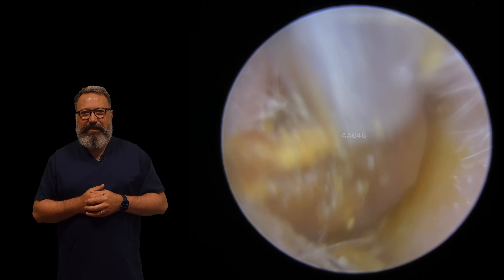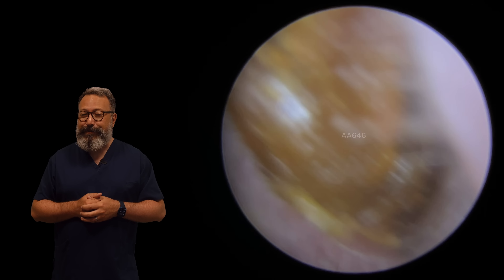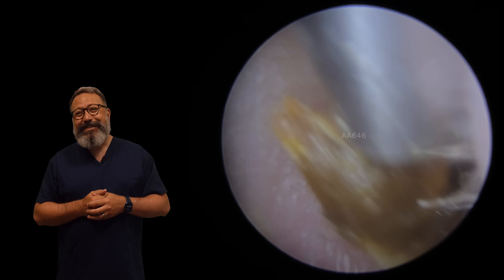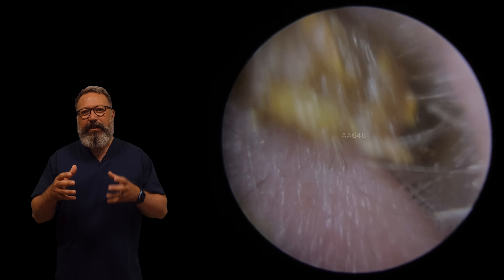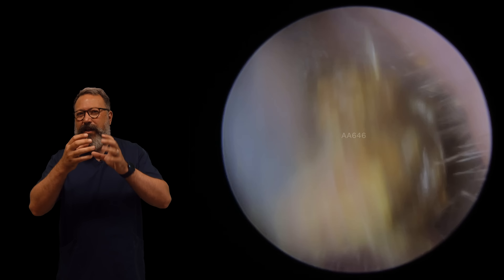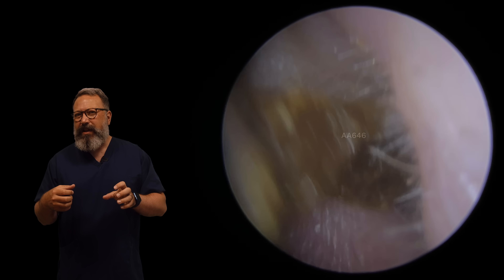We're wiggling our socks off here - almost turbo wiggling. So this is coming away really nicely. You can really see that plug starting to work its way out now. You can see we've got a lot of movement to the front end, but that back end is still just inside the ear canal. Not a tremendous amount of movement there.